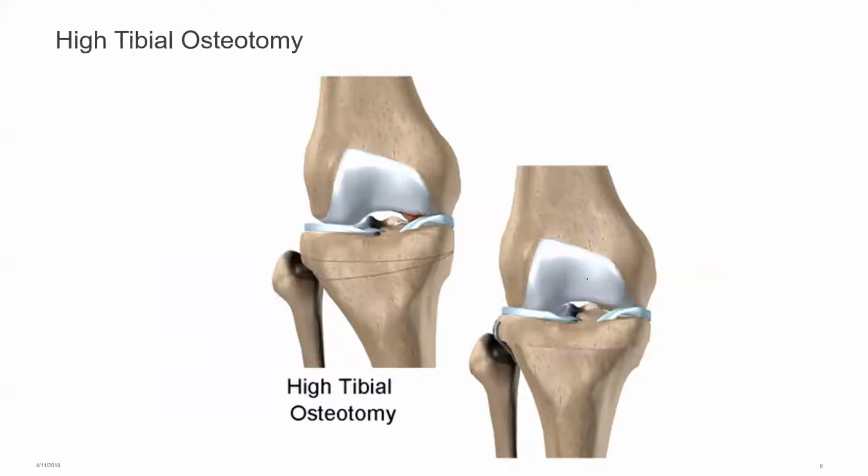Another area is high tibial osteotomies. So an unloader is often used in these instances when they want to test the methodology of reducing the load in that unicompartmental affected osteoarthritic knee. So in a high tibial osteotomy, you can see this triangle here. And what this is effectively doing, they take that triangle of bone out. So you can see before this operation is done, that knee is in a varus position. And by removing it along this line and then placing a plate and 2 screws like that, you can see that we've effectively changed the tibial varum, and we've now got a more straight leg. And the function of that is to shift the load line from a more medially directed line to moving it a bit more laterally to control that. So you can use an unloader to predict how effective that surgery will be.